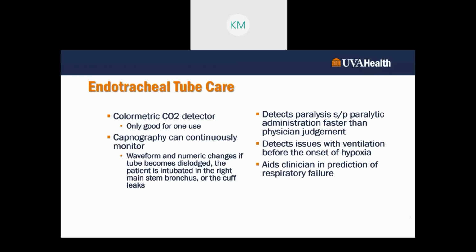In fact, if I use end-tidal CO2 in my capnography before we intubate my patient, it can help my physician detect paralysis of my patient faster than the physician's judgment. It'll detect issues with my ventilation before the onset of hypoxia as we continue monitoring our patient here. And it's going to aid us in the prediction of respiratory failure. So if I can intervene faster than I normally would have, why would I not utilize this device? It's a fantastic device to use. All right, so utilizing the tools that we have available to us.